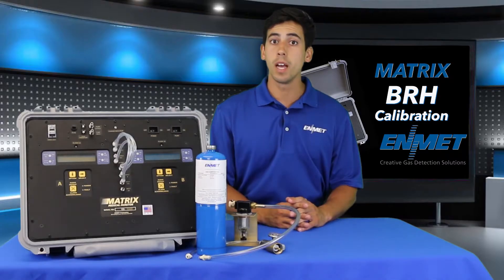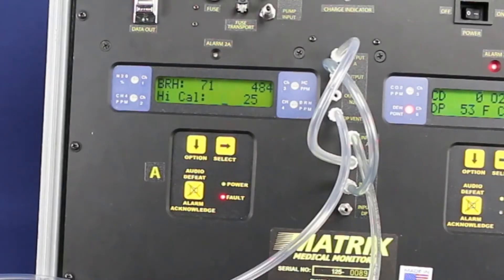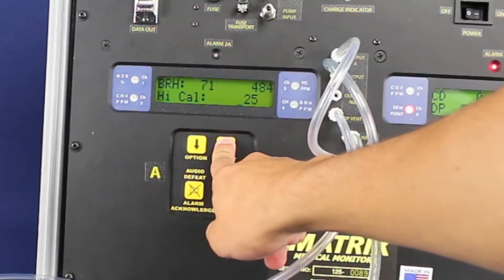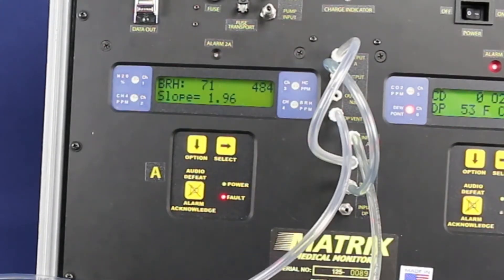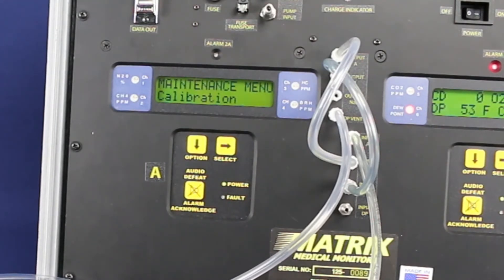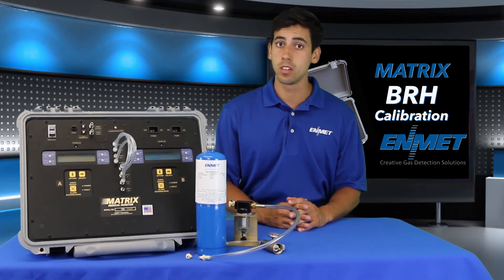Once the signal stabilizes after about four minutes, you will accept the calibration. To accept the calibration, use the select key to move the cursor over to the right until cal okay is displayed. The slope and the offset values will be briefly shown and it will return you to the maintenance menu. This completes the matrix calibration for the BRH sensor.